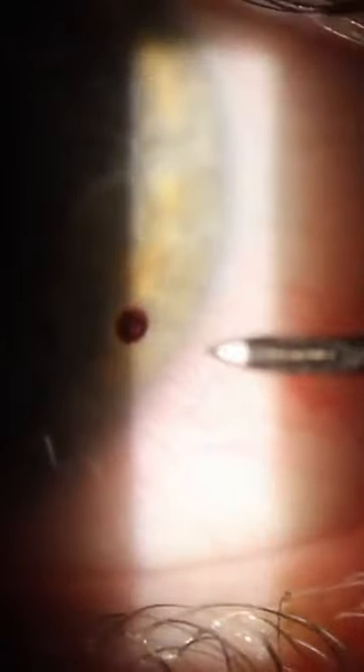As you can see here, there's a peripheral corneal foreign body that's quite metallic in nature. I'm using the needle and keeping it parallel to the eye to easily remove that little foreign body, which had been in for a couple of days and so had rusted into the eye.